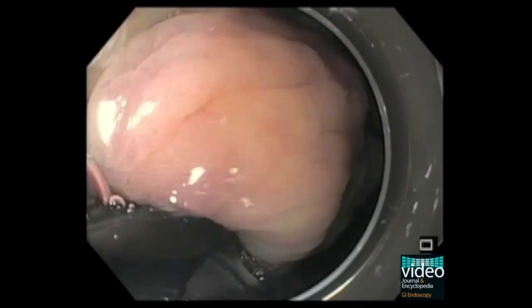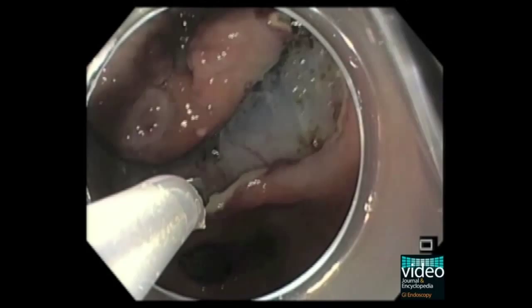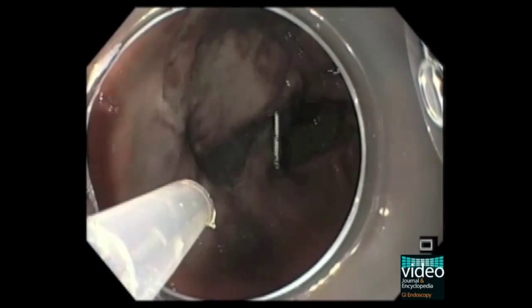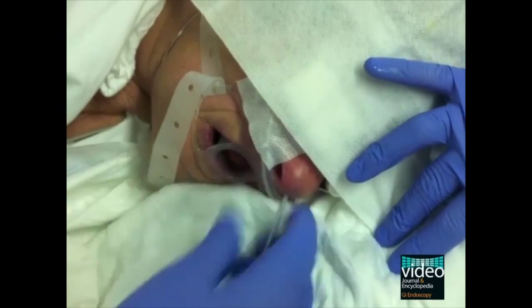In the yo-yo technique, a clip is placed in the appropriate margin of the lesion. Tape is placed in the tip of a snare to avoid mucosal injury. After applying gel, the snare is carefully inserted through the nose using endoscopic guidance.